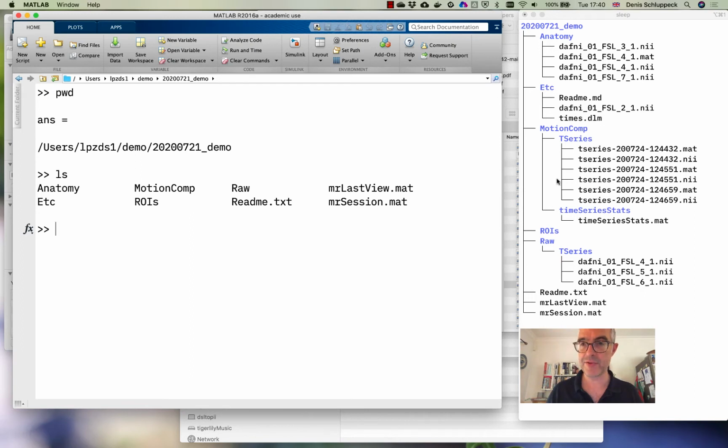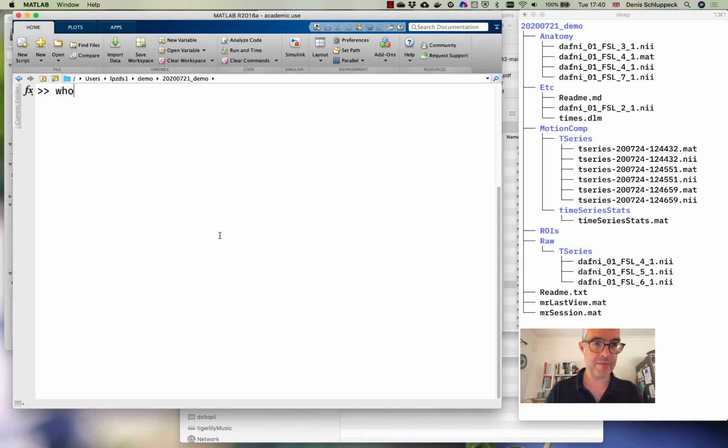represented here, right? So I've got this loop going that updates me to changes in the file system. So at the moment, the workspace in MATLAB is empty, apart from this variable, ans, which is just some text that was stored there. I can make sure that's gone. All right. And so we can actually get a view without starting the interactive window at all.